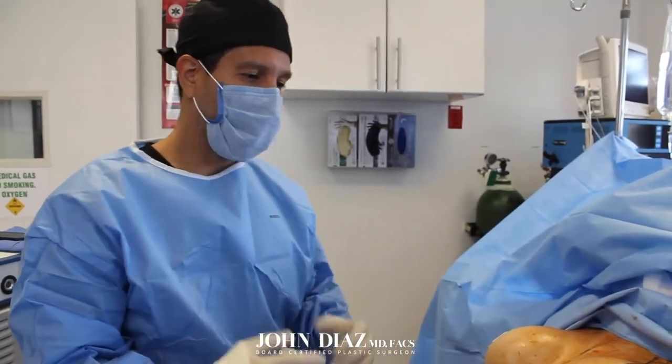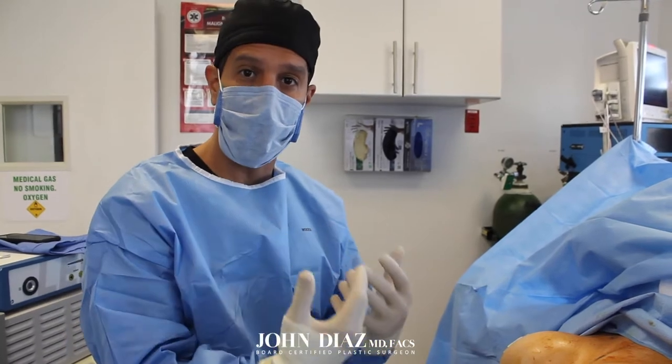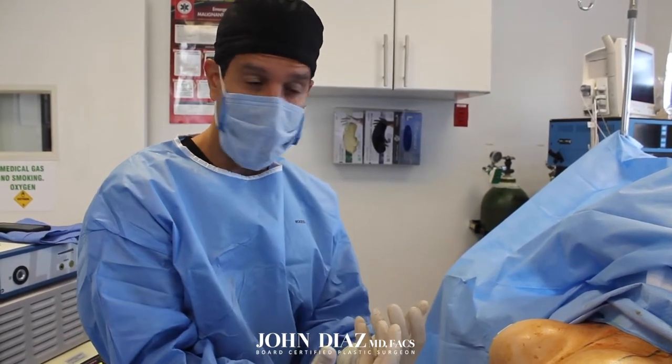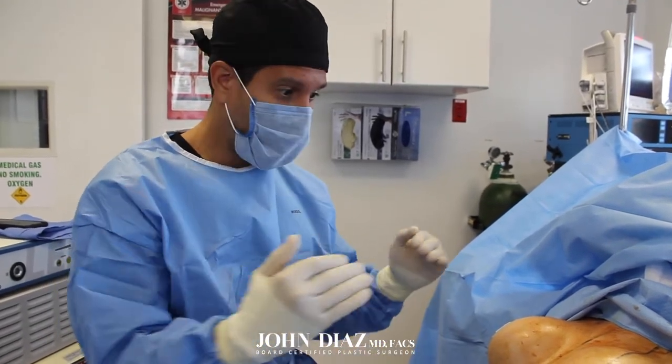So the plan is to go in, remove these implants, remove the scar tissue, restore her breast to a more natural and soft shape, and then insert new implants and do a lift in order to give her better symmetry.